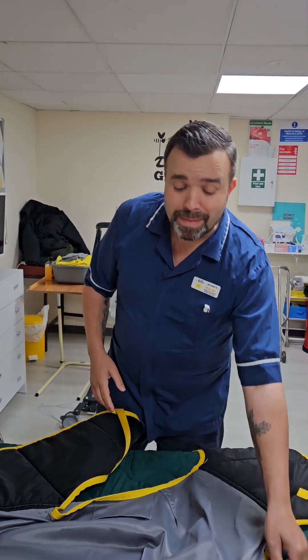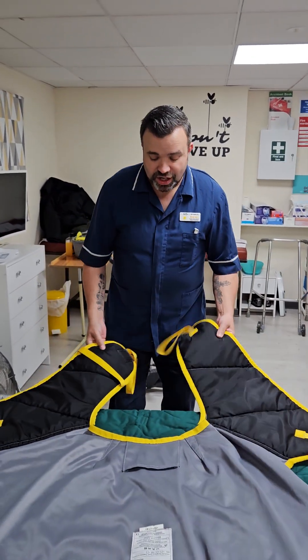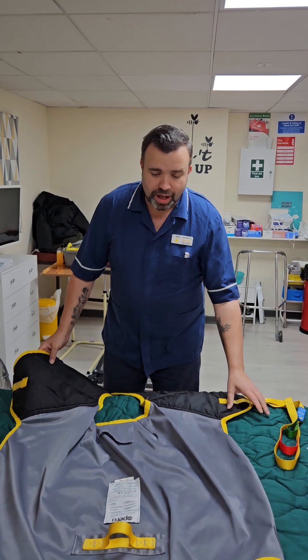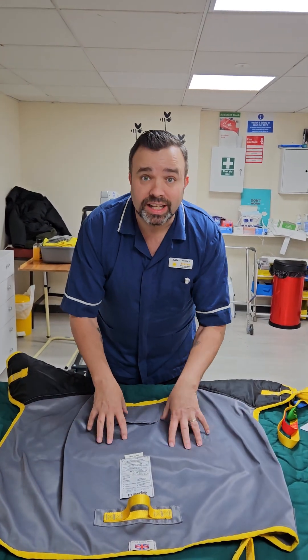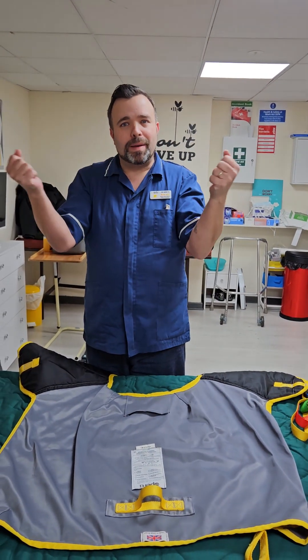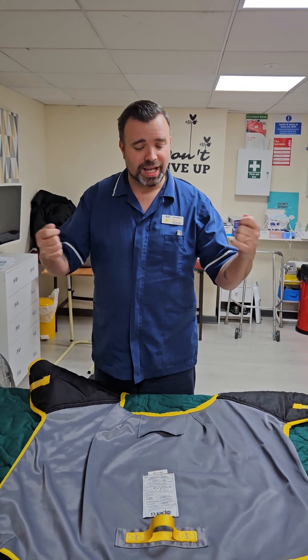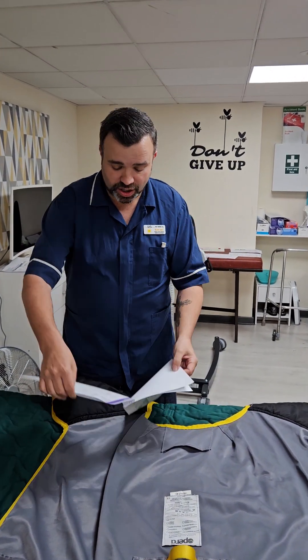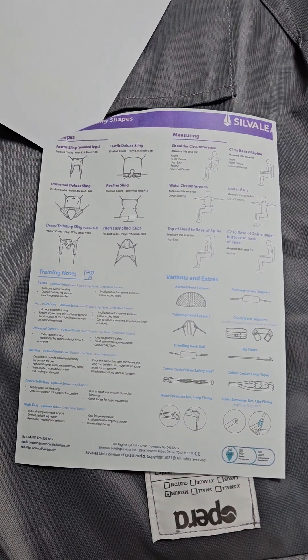It's important to remember that there are different types of slings with different types of apertures. This aperture here creates the space for the bottom, and this type is good for moving from bed to chair. Some slings stay in the chair — those are the black ones that are a bit more stretchy — while others are designed to move a person from one place to another and can be taken in and out. Familiarise yourself with the SOP, as at the back there are pictures of different types of slings for different types of activities.